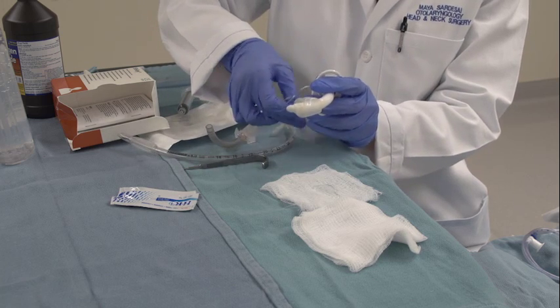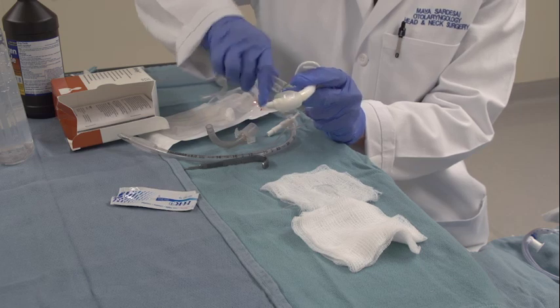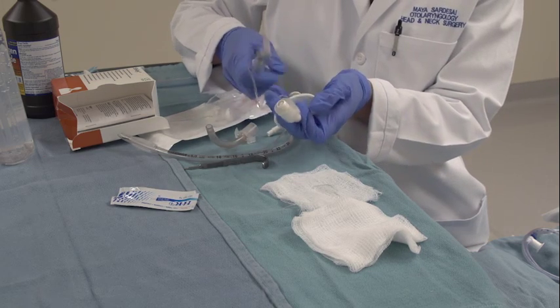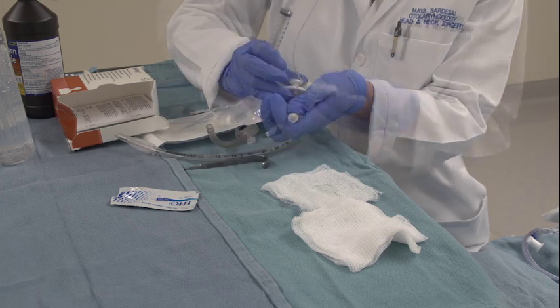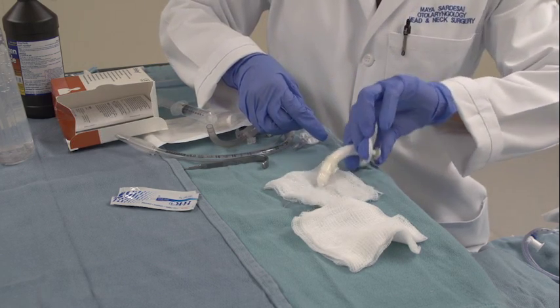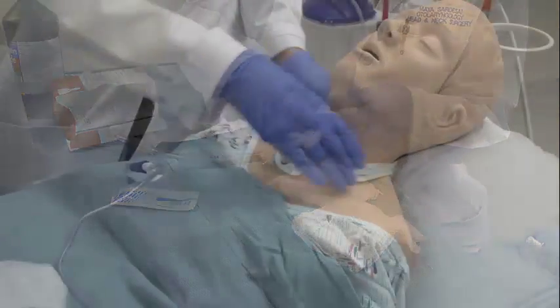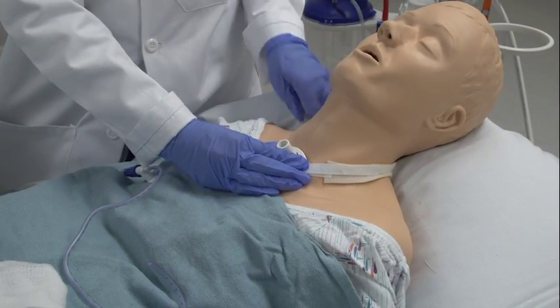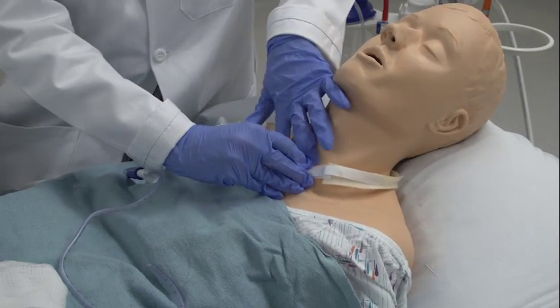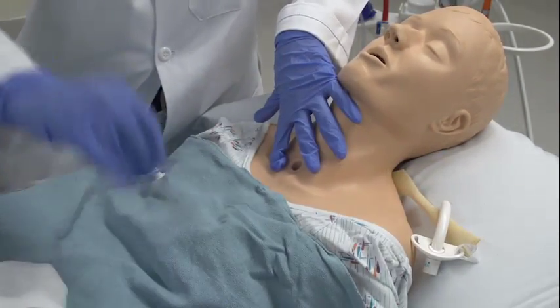You should replace the tracheotomy tube with the spare trach from your emergency supply. First, check the integrity of the cuff by inflating the cuff and checking for leaks. You will then deflate the cuff and position the patient for reinsertion. The best position to reinsert is for the patient to be flat with their neck hyperextended. You may place a blanket or pillow under their shoulders. Do not hyperextend the neck if the patient has a confirmed or suspected cervical spine injury.